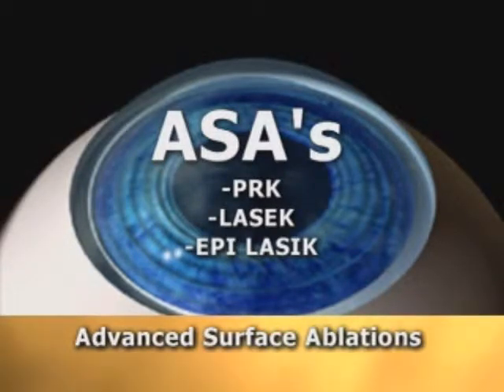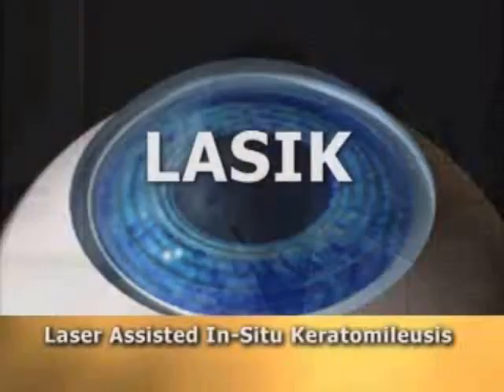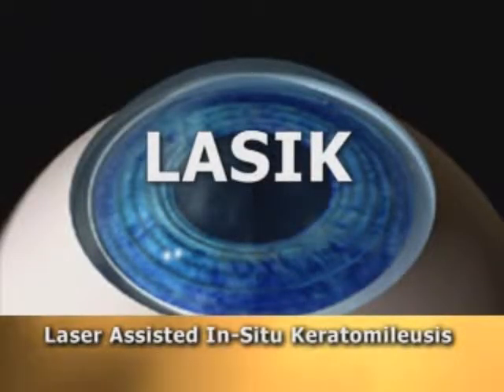In the early 90s, surgeons in Europe combined the accuracy of excimer laser sculpting with the comfort and rapid rehabilitation of a flap-creating procedure that originated in Colombia in the early 60s. When the laser is used to remove corneal tissue from its inner aspect after creating a flap, the procedure is called LASIK, or laser-assisted in situ keratomileusis. LASIK literally means to shape the cornea within using a laser.